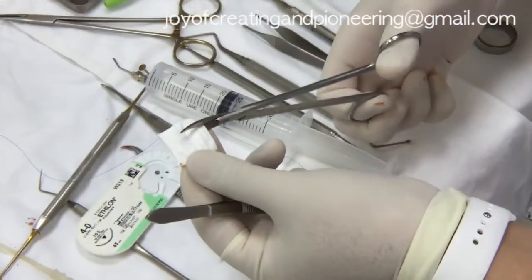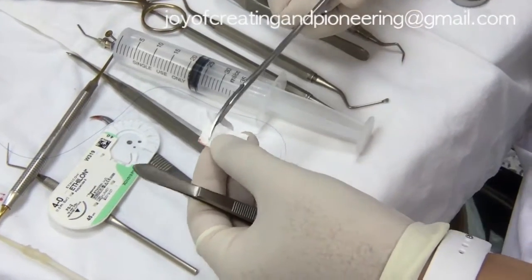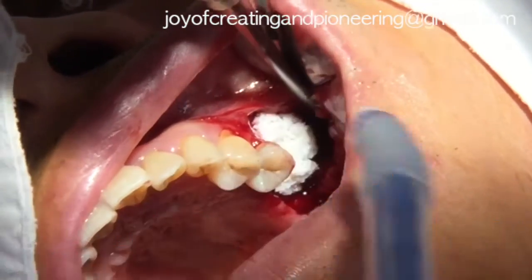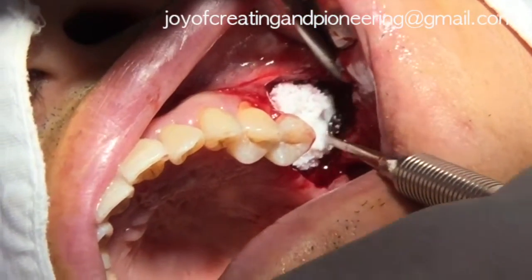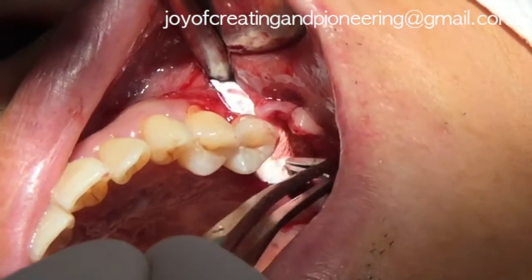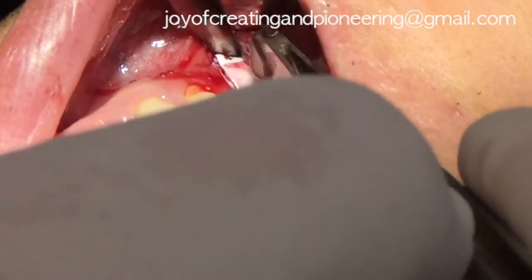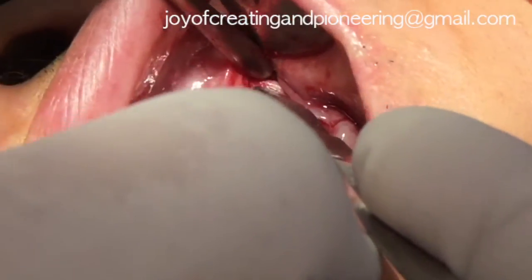The Bio-Gide membrane, which is a resorbable collagen membrane, was trimmed to fit over the defect. The rest of the Bio-Oss bone graft was applied for the vertical and horizontal GBR. The Bio-Gide membrane was carefully applied and a slight drop of saline was applied to provide better adaptation. Additional membranes were applied for the double layer technique.